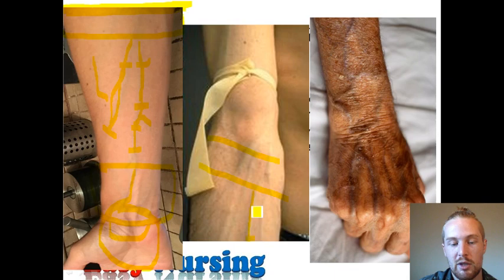So I definitely would avoid this positioning problem. I'd probably start anywhere from here to here. These 2 veins are the most easy to view. I do see another vein running here and here. So this really gives you 4 good shots.